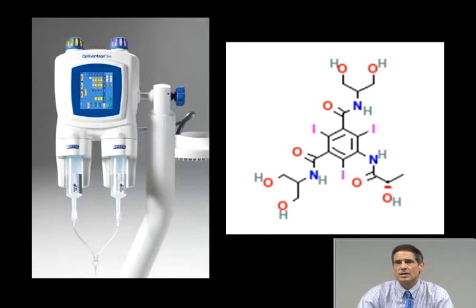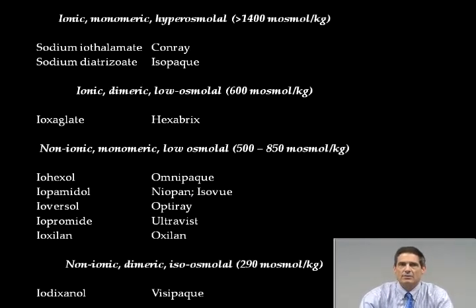For CT exam of the chest, you want to use contrast. That'll involve a power injector and typically non-ionic contrast. There are several varieties of contrast as noted on this slide, and historically the development has been from the top of that slide to the bottom, with older generation ionic contrast supplanted by ionic and non-ionic contrast. I'll actually give a lecture a third of which is devoted to contrast, so I'm not going to go into a lot of detail about contrast here. I will note that it's changed through the years.